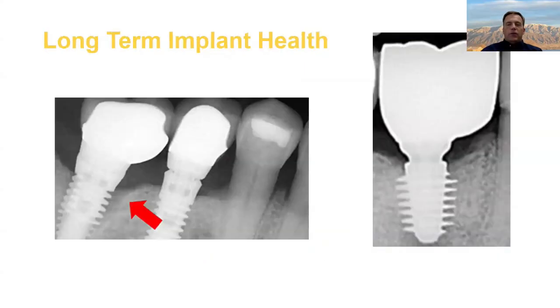So back in the day, when we first started doing dental implants, the platform would be placed equicrestal, just like it is now, but most of the time, radiographs over time would show crestal bone resorption, sometimes as much as 0.5 millimeter a year. In the olden days, we were more like, well, if the implant stays, that's a win. So we weren't as concerned about that. Over time, people have gotten to where they don't really like seeing that gray edge above their gums when the bone resorbs. So implant manufacturers have been working hard to enhance crestal bone retention.